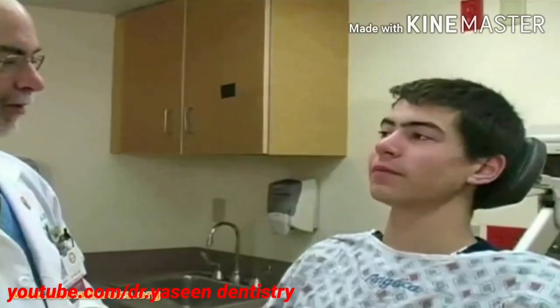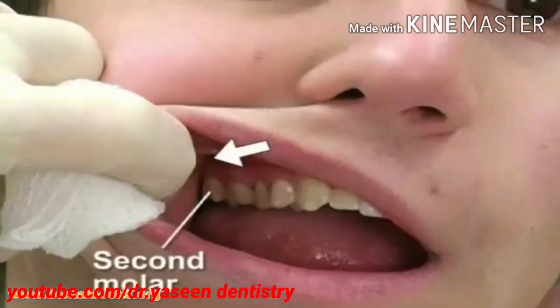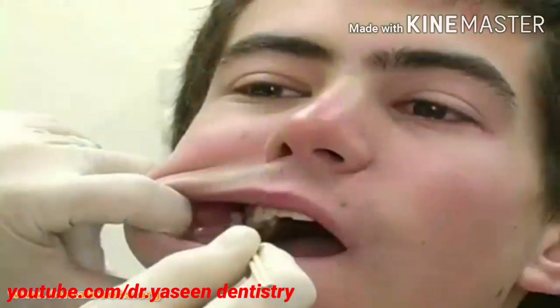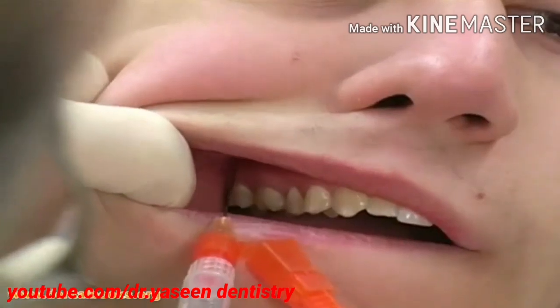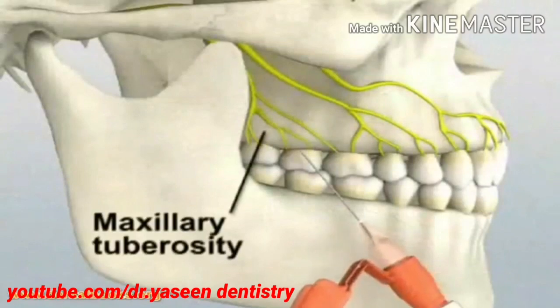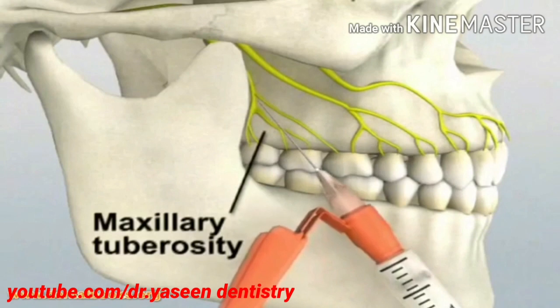To perform the block, position the patient sitting upright in a dental chair or stretcher so that the occiput is firmly supported. Needle entry occurs in the mucosal reflection just distal to the distal buccal root of the upper second molar. Dry the buccal mucosa around the area with a piece of gauze, and then apply a topical anesthetic such as benzocaine. Insert a 3.5 centimeter, 25 gauge needle through the buccal mucosa and direct it toward the maxillary tuberosity in an upward, backward, and inward direction.